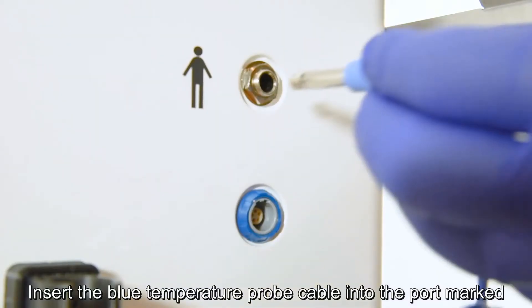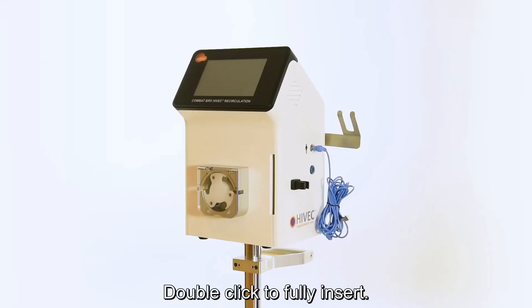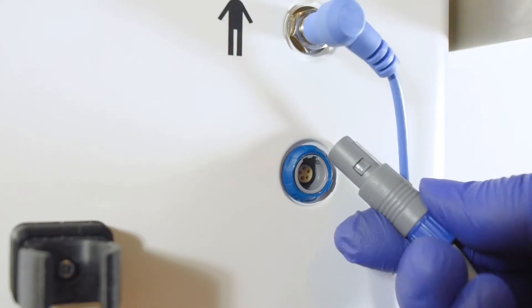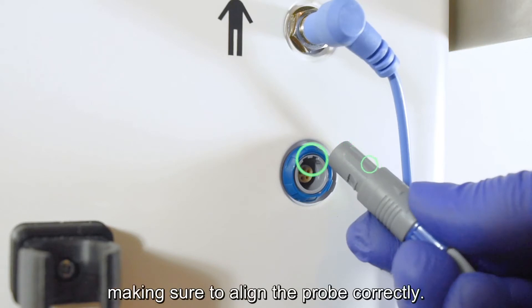Insert the blue temperature probe cable into the port marked with a picture of a person. Double click to fully insert. Fit the grey pressure cable into the lower port, making sure to align the probe correctly.